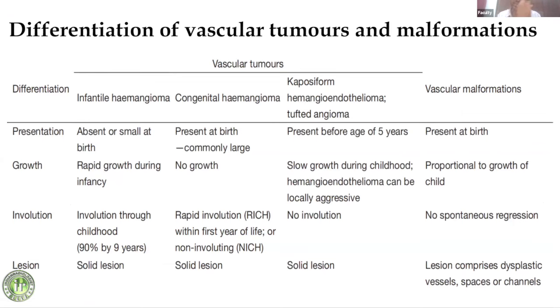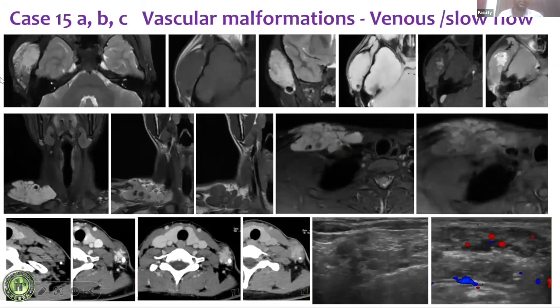Rather, they will present with some vascular channels, ill-defined infiltrative kind of. It can be multicystic in case of the lymphatic malformation, or if it is a venous malformation, there will be some vascular channels, or there may be some ill-defined soft tissues, but not a very well-defined soft tissue and enhancing that is seen in the classic hemangioma. So these are the different cases in the pediatric population.